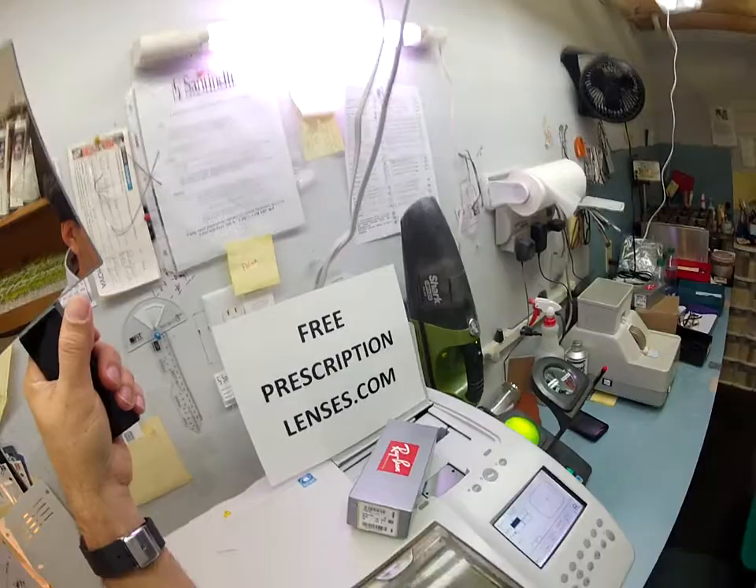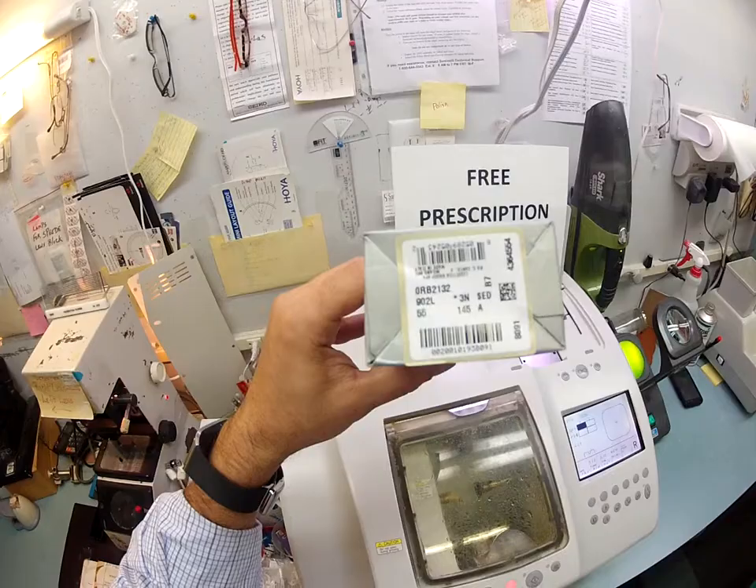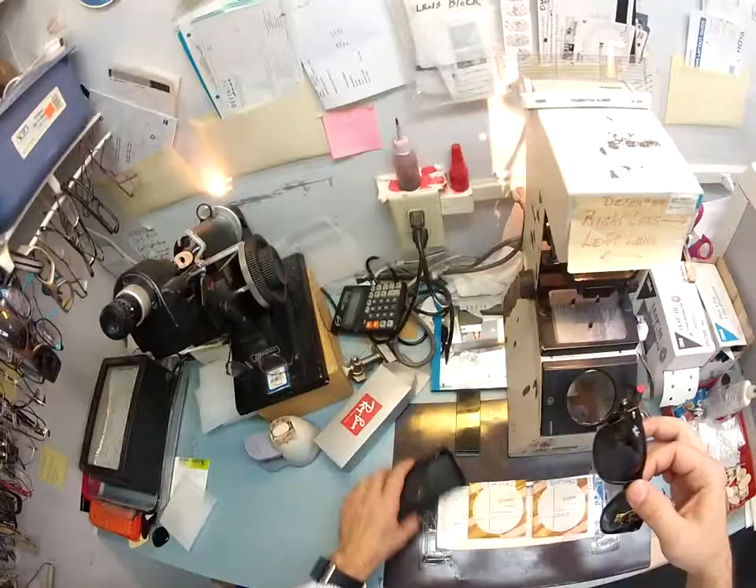Hello Kenny in Seattle, Washington. Matthew here with FreePrescriptionLenses.com and with the help of my GoPro camera, I'm going to show you how I cut Transitions Brown lenses with anti-glare for your Ray-Ban 21-32 New Wayfarer, color 902L, which is the large tortoise and the 55 eye size. So let's get started because I've got a lot to show you in 21 minutes.